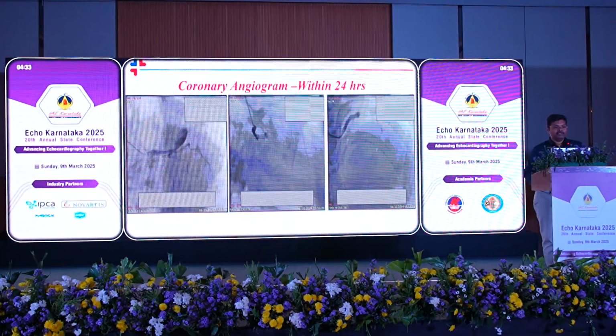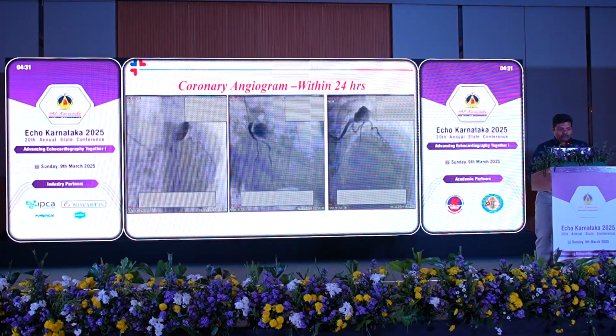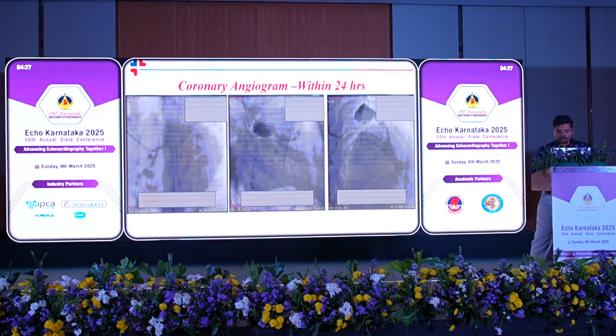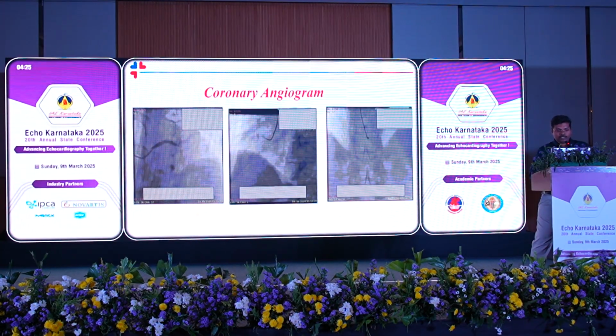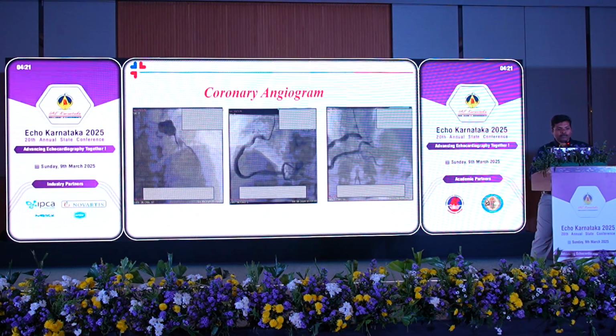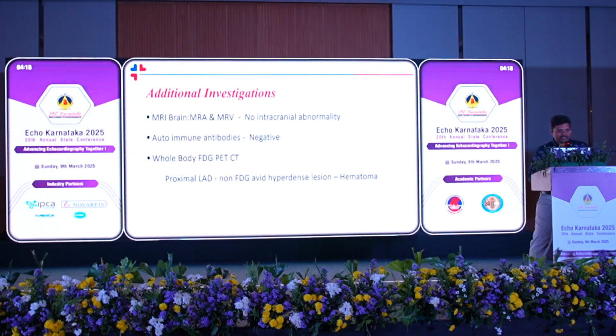Then he proceeded with coronary angiogram, which showed a proximal LAD giant aneurysm with distal TIMI 2 flow, and the right coronary artery was ectatic with slow flow. So we moved on to additional investigations like MRI brain with MRA and MRV to rule out any intracranial aneurysms.